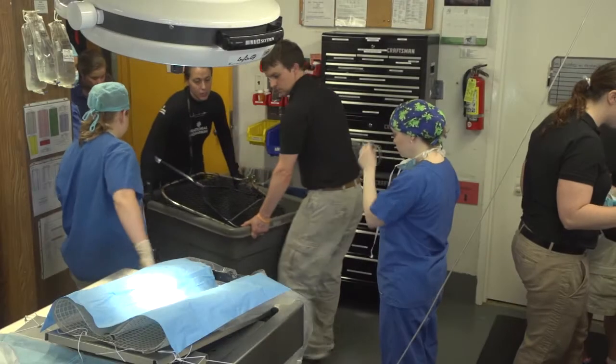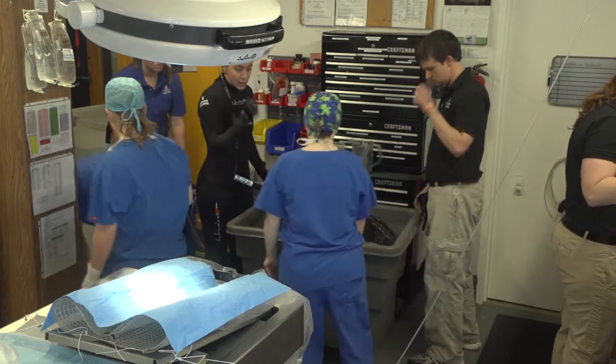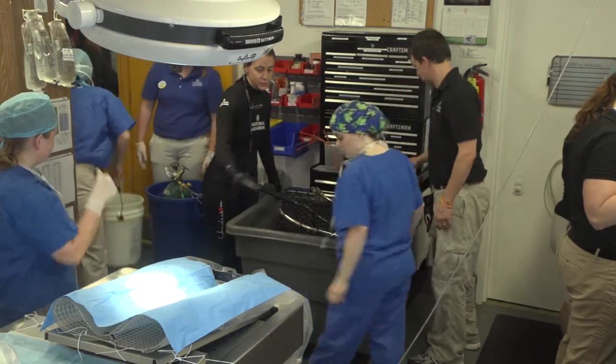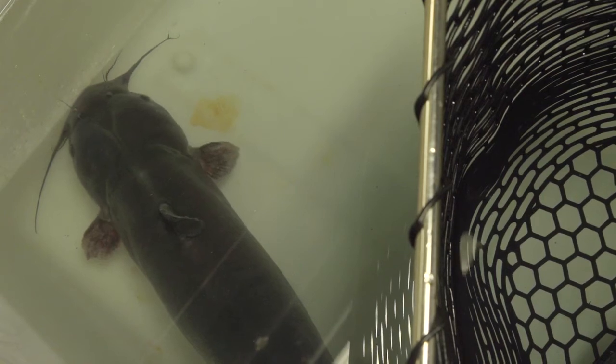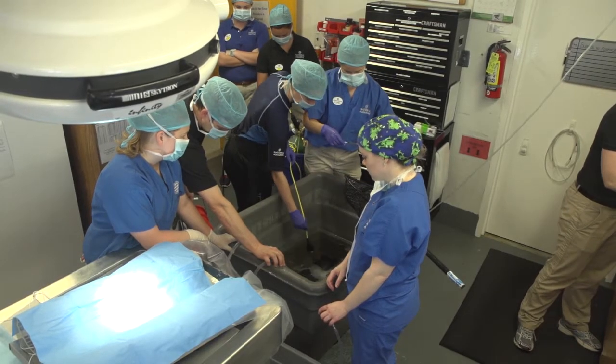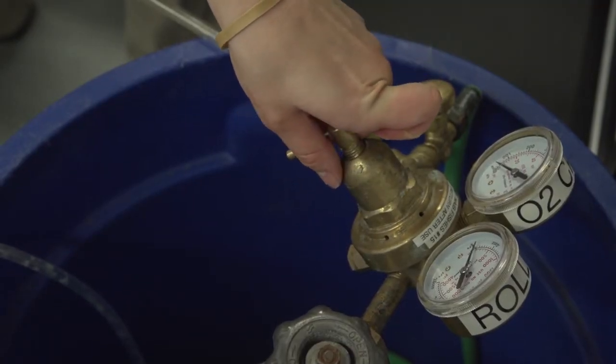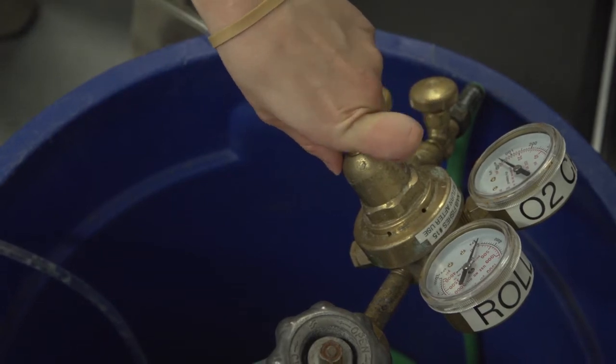We had the aquarium team catch her out of her enclosure and bring her down to the surgery room. At that point, we check certain things like making sure she is gilling okay, making sure that the temperature of her water is at an appropriate level, and making sure the oxygen content of her water is at an appropriate level.